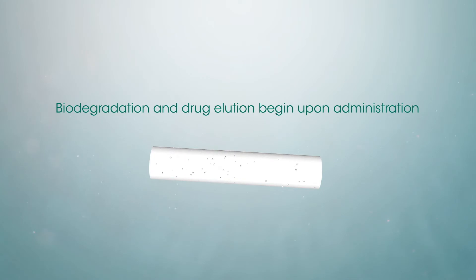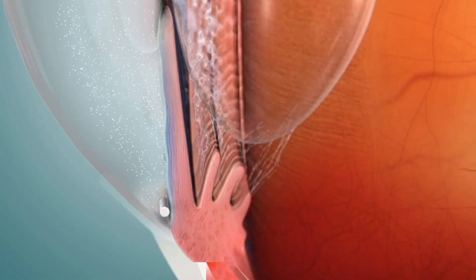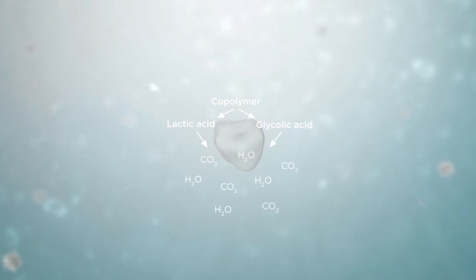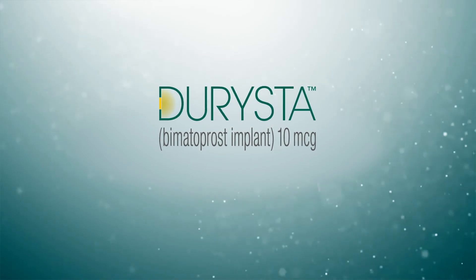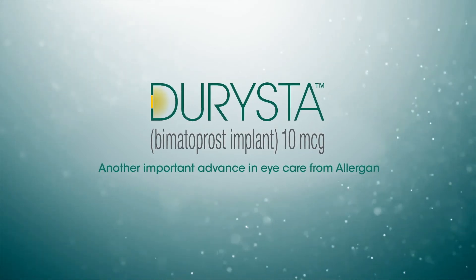Biodegradation starts upon administration. As the implant biodegrades, drug elutes. Darista administration bypasses the ocular surface. After administration, the biodegradable polymers are reduced to water and carbon dioxide over time; therefore, the Darista implant does not remain in the eye permanently. Sustained-release intracameral Darista is a paradigm shift in the treatment of open-angle glaucoma and ocular hypertension — another important advance in eye care.